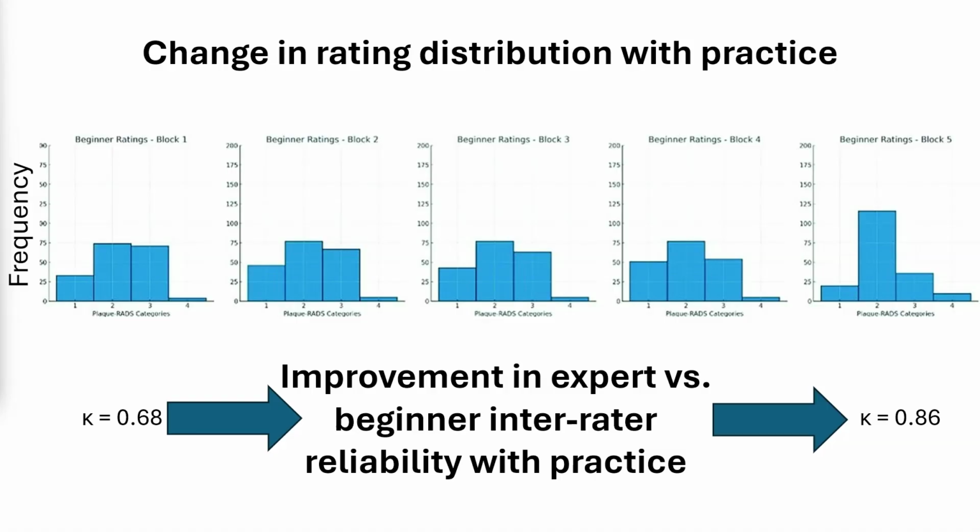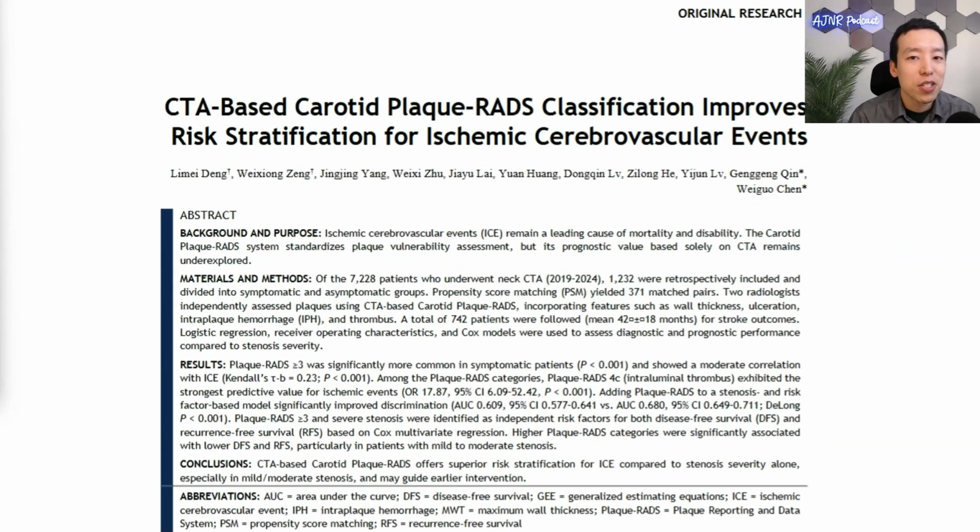And I should note that the resident didn't even get any feedback between blocks. And so I would expect that with corrective feedback, as is routine in education settings, this learning curve would be much shortened than 500 studies. So we see that Plaque-RADS is relatively reliable.